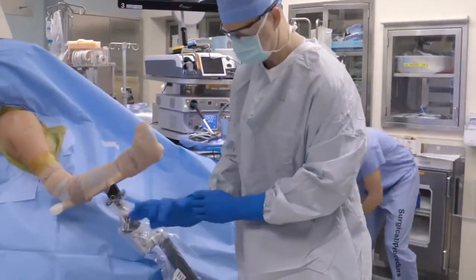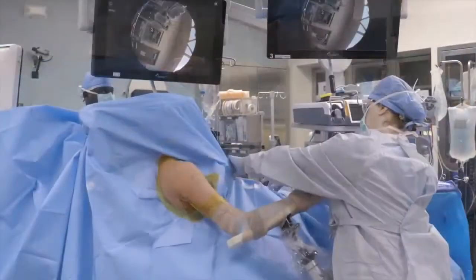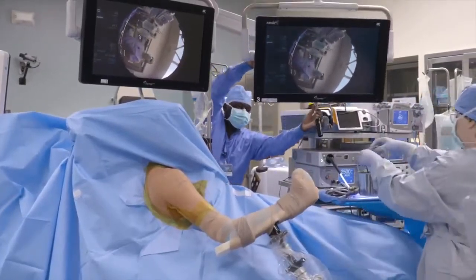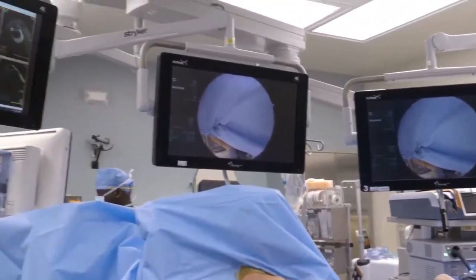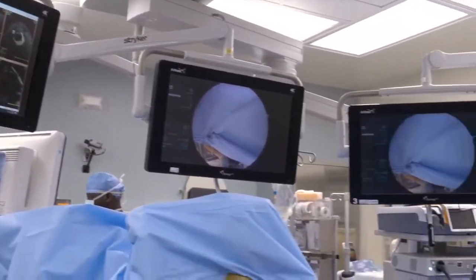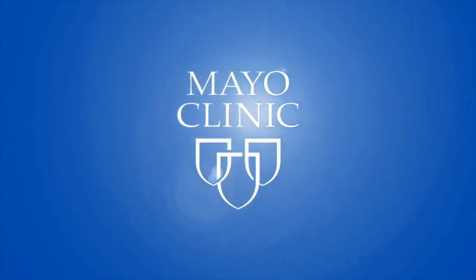Anyone who participated in draping then changes their outer gloves. The arm is then positioned for arthroscopy with a little bit of flexion. The drapes are secured and the screens are brought down into place. The pedals are appropriately positioned and the screens are set up so that we have two screens showing the arthroscopic view and one also showing patient-specific images. We are now ready to pause and perform a safety check and begin with the case. We thank you for your time and attention.